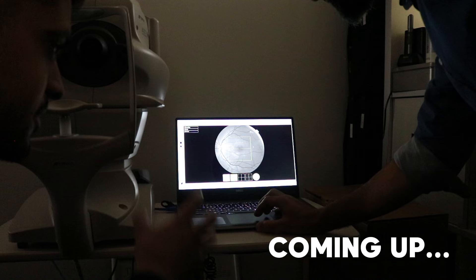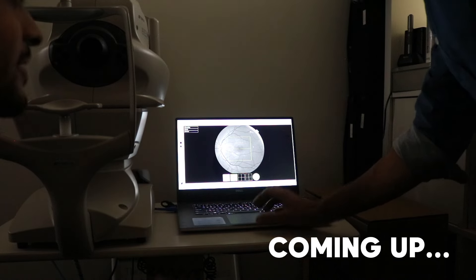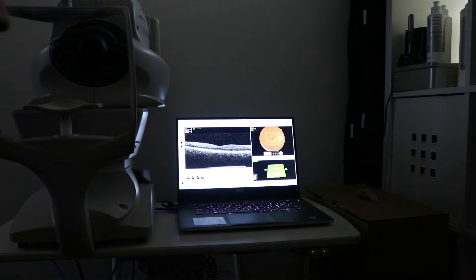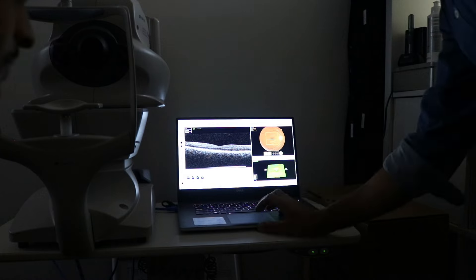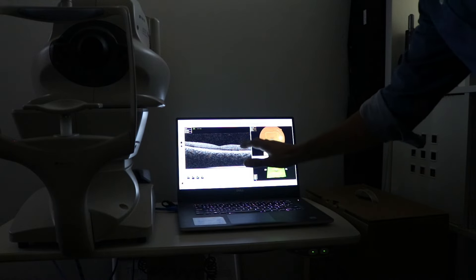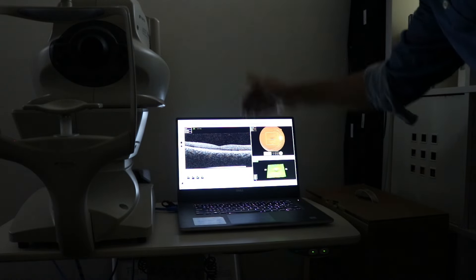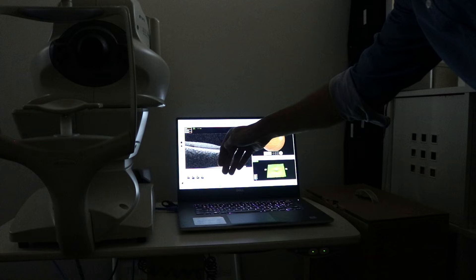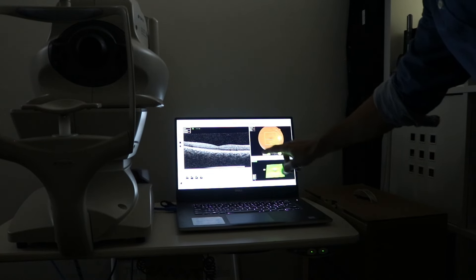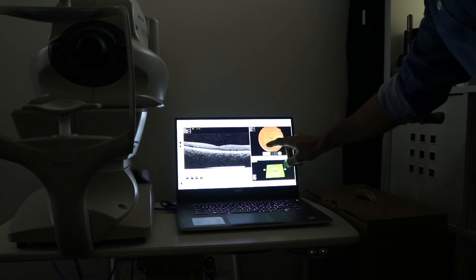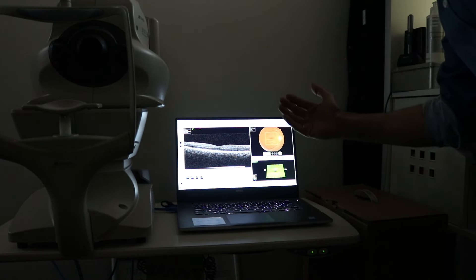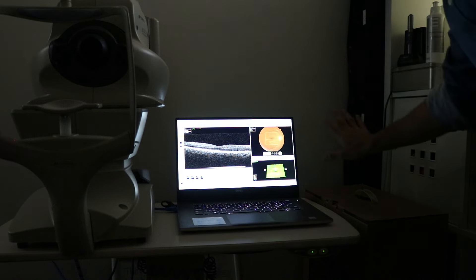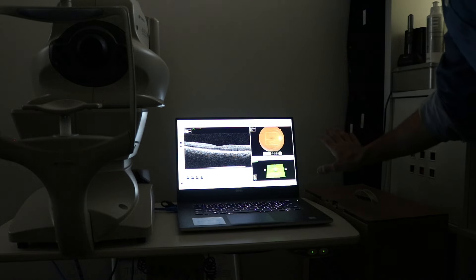And is it just those small signs that you look for? So let's start from here then. The OCT gives us a section into the retina, and then the fundus image, which is what we call an enface image, gives us the surface picture of the retina.